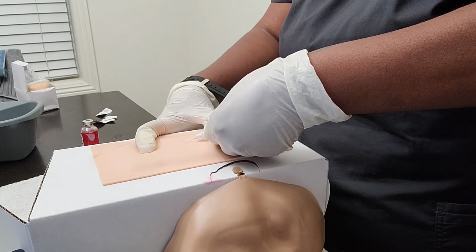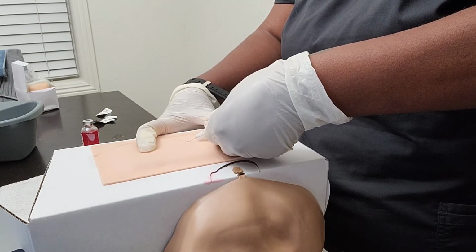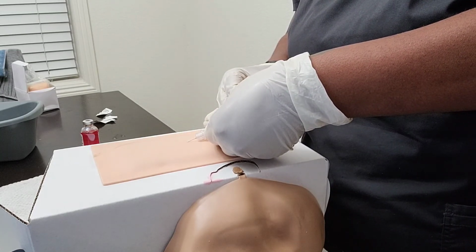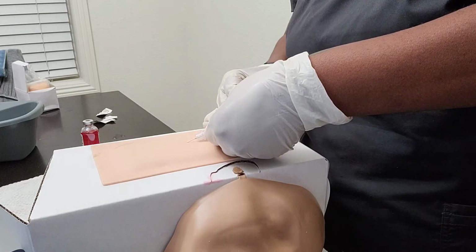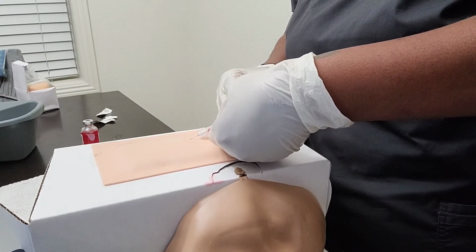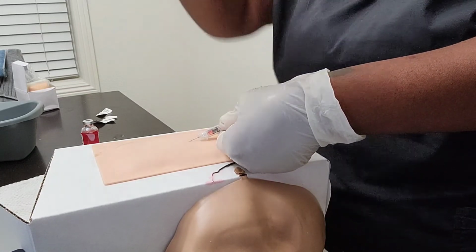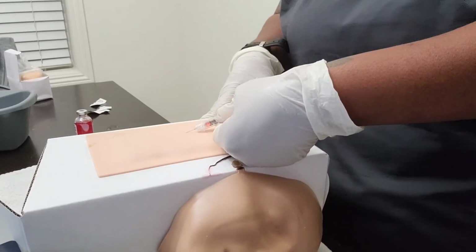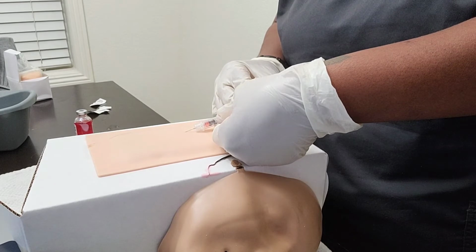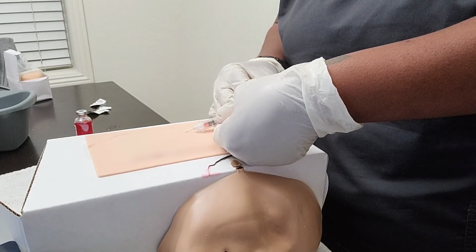Okay, and then I'm going to insert the medication in, and that's 5. Hopefully you can see that. I'm going to move my hand so you can see a little bit better for video purposes, hopefully. And I'm going to inject the medication in slowly.